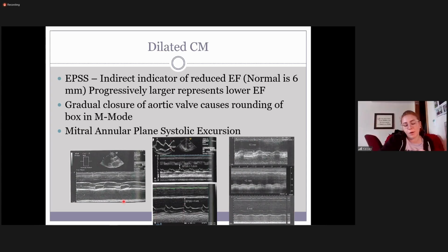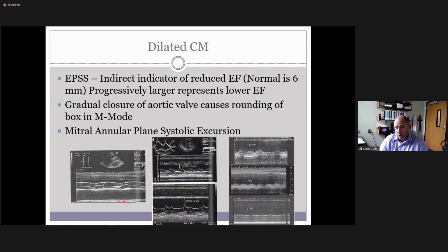Is it due to low cardiac output? Yes. So there's simply not enough volume to hold the leaflets open, and the heart is weak, so it's not pushing it out super well. So the pressure from the aortic side is pushing back on it as it's trying to push the blood out still. It's still contracting, but it's starting to taper off just because it's not being able to overcome the aorta pressure. And therefore it shuts a little bit early. It doesn't come to a rapid snapping shut like it normally does. But that's kind of why that occurs.